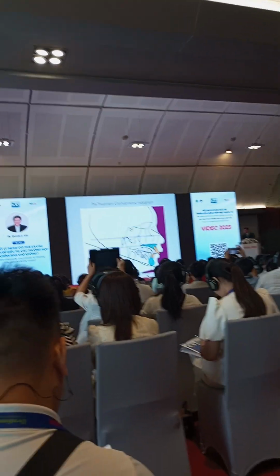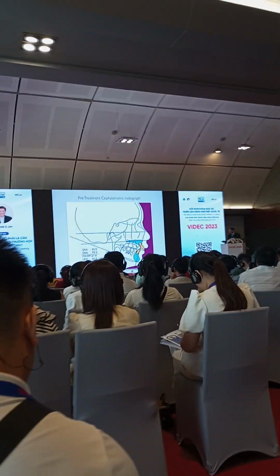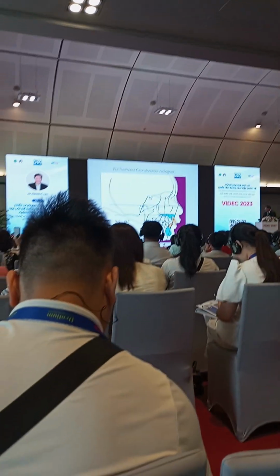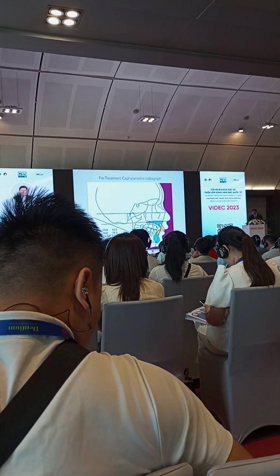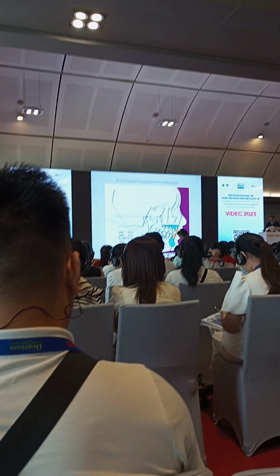ODI is what we refer to for either an open bite or a deep bite. So a very high 85 is considered a deep bite case. And APDI of 68, normally it's 81, so it's a skeletal class 2 facial appearance. So we can probably say this is a skeletal class 2 with a retruded mandible.